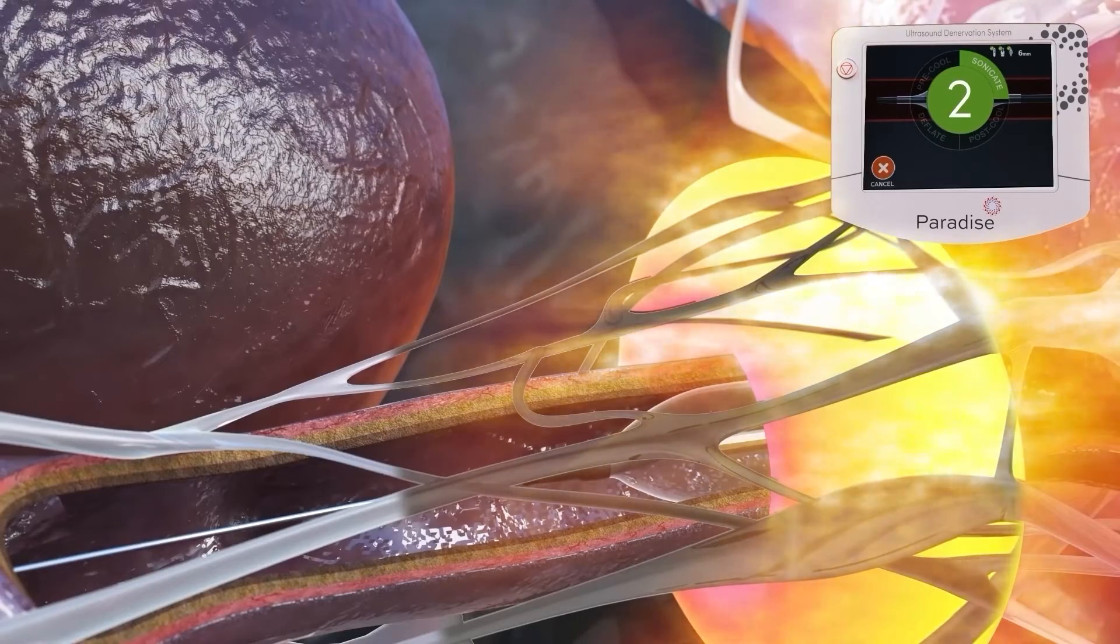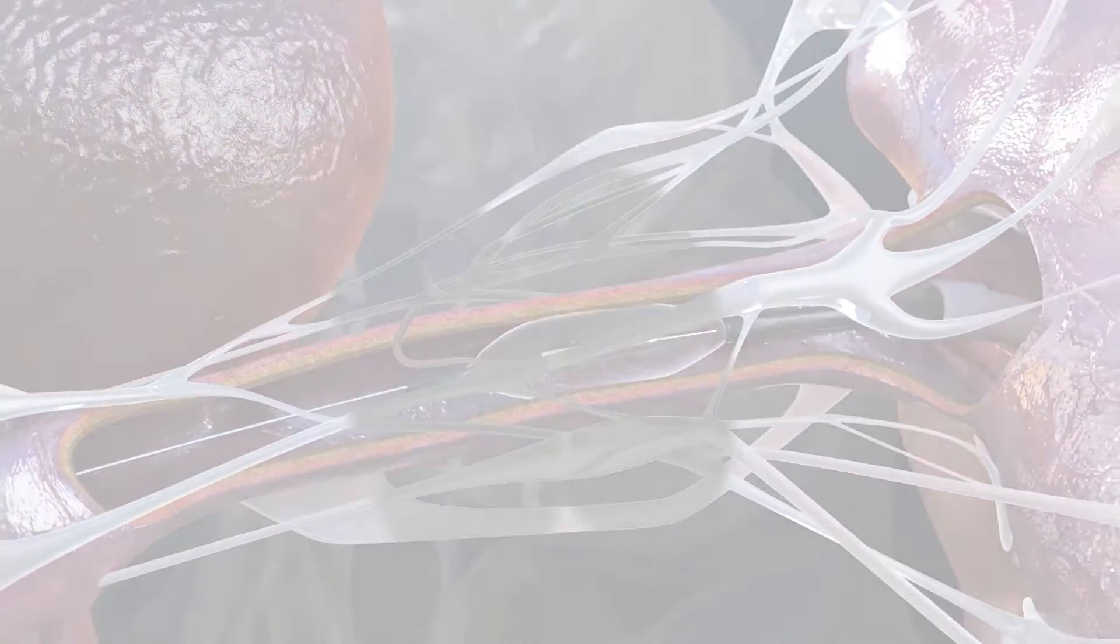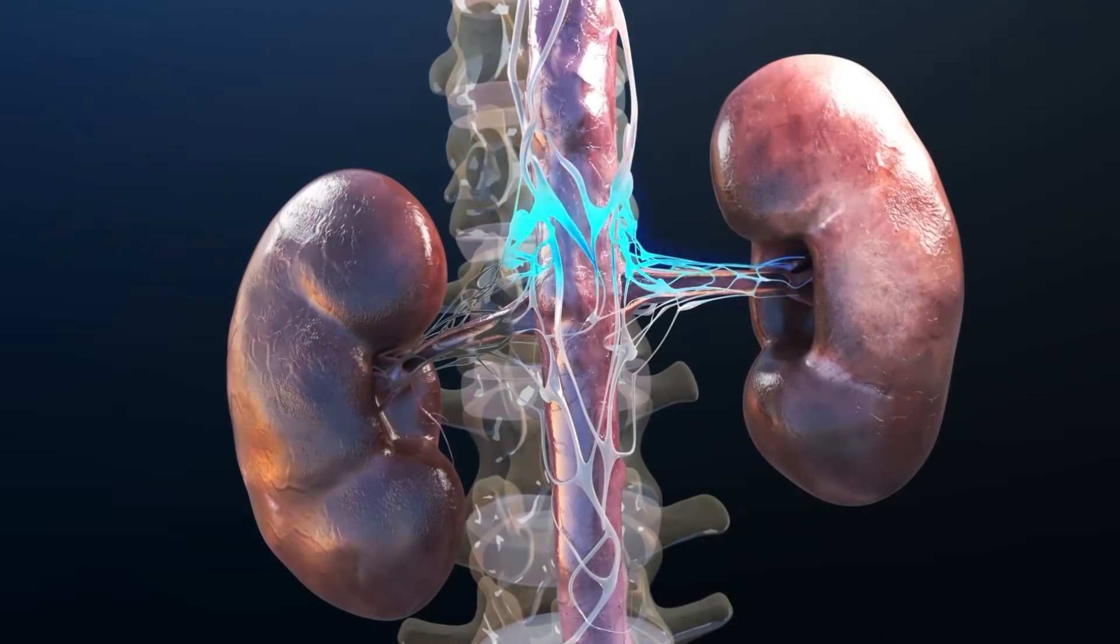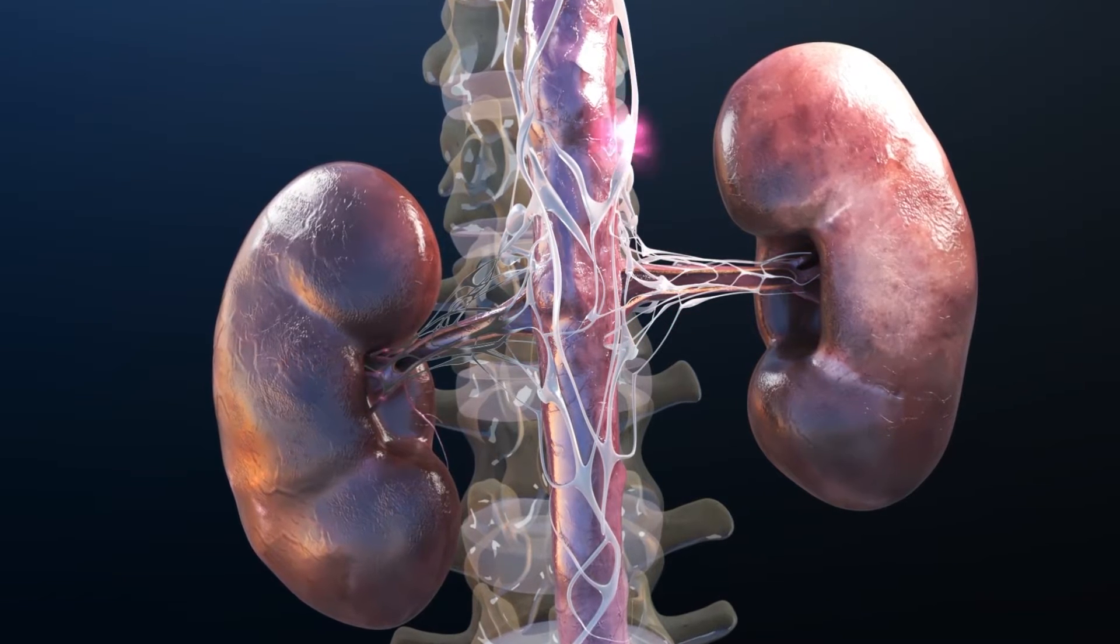The Paradise treatment strategy is two to three sonications per each main renal artery, with each sonication lasting seven seconds. No treatment of the distal branches is needed to achieve clinical benefit.